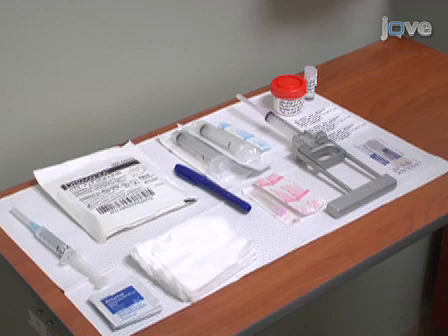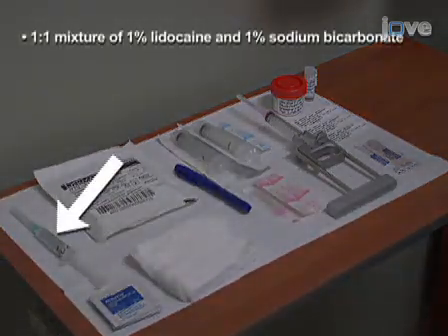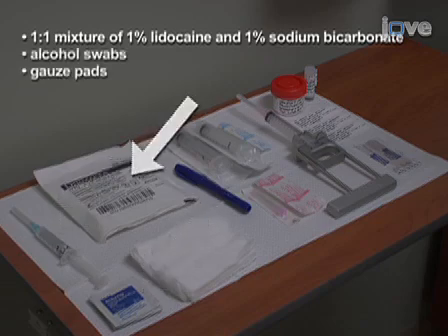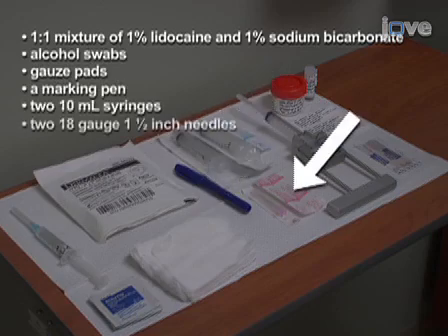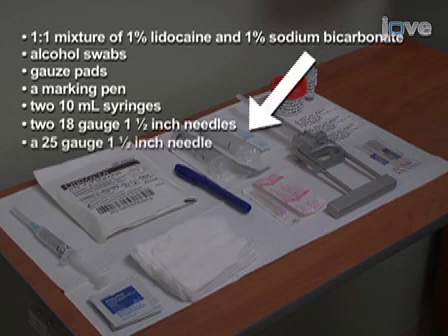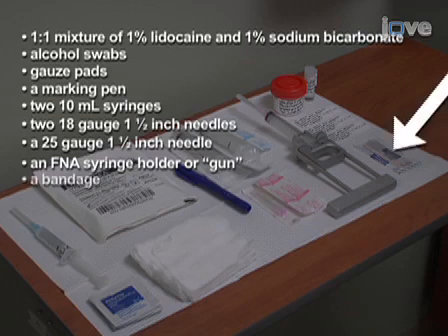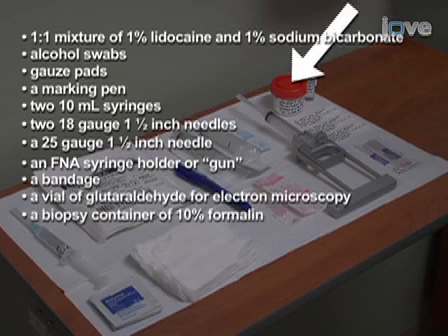Prepare for the procedure by gathering all of the materials needed, including a 1 to 1 mixture of 1% lidocaine and 1% sodium bicarbonate, alcohol swabs, gauze pads, a marking pen, two 10ml syringes, two 18 gauge 1.5 inch needles, a 25 gauge 1.5 inch needle, an FNA syringe holder or gun, a bandage, a vial of glutaraldehyde for electron microscopy, and a biopsy container of 10% formalin.